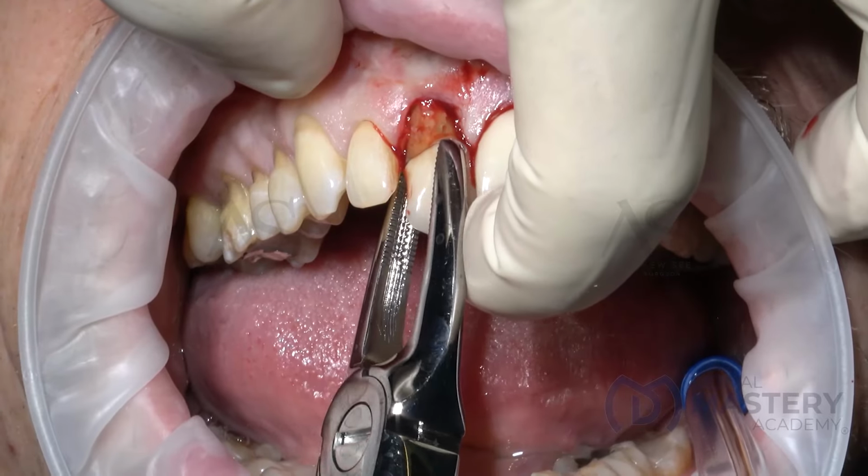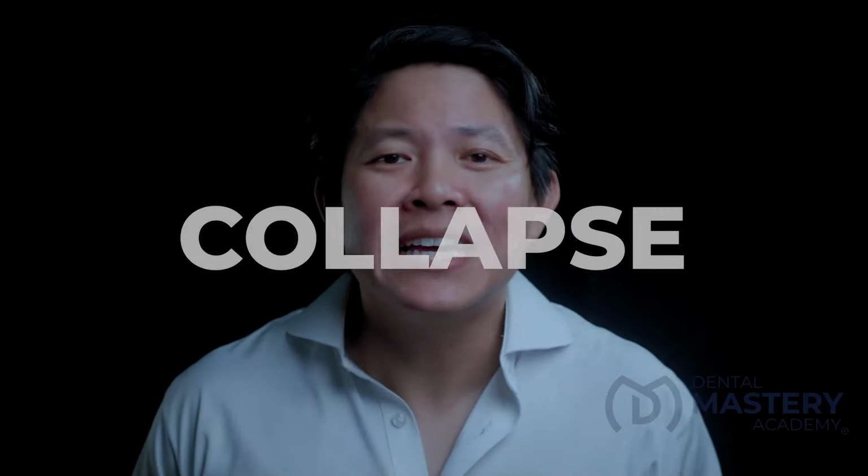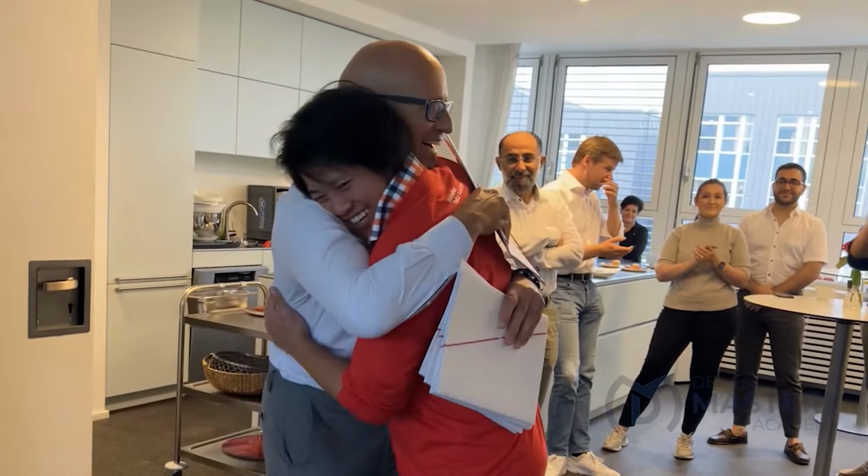Biology tells us that if you remove a tooth in the aesthetic zone, the buccal bone will collapse even with an immediate implant placement after extraction. After several years of utilizing the socket shield technique, first documented by Hürzeler and Zuhr in 2010, I believe that this is currently the most optimal technique to maintain the aesthetics with implants in the aesthetic zone.